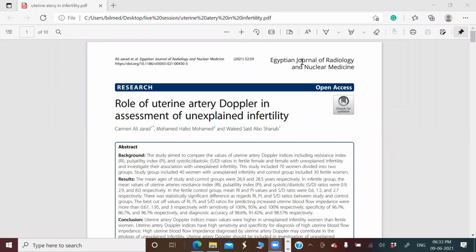Towards ovulation. Now, there are different studies which are conducted. Some are conducted at day 2 and some at day 12. Depending on which study you are seeing and which tables you are using, accordingly you have to select whether the patient should be scanned at ovulation, near ovulation, or earlier in the cycle.